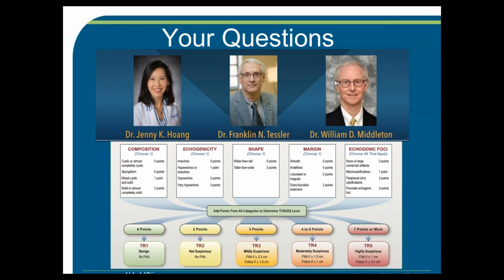Okay, that's very helpful. Okay, Franklin, back to you. Do you ever use TI-RADS for pediatric patients? This is from Claudia. In our hospital, the endocrinologists mainly follow ATA recommendations for pediatric patients. That's an excellent question. I've received it from some practitioners here at UAB as well. Formally, ACR TI-RADS only applies to the adult population.